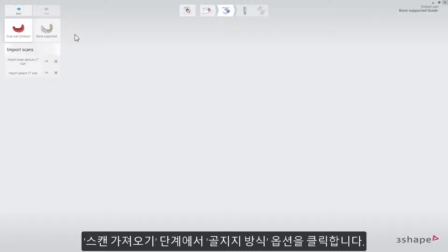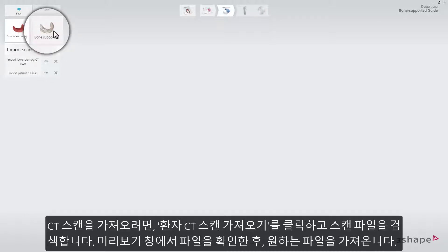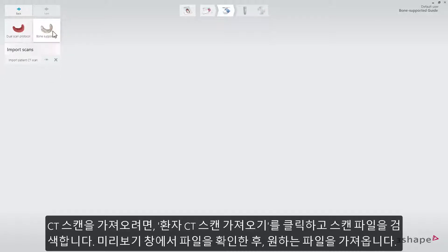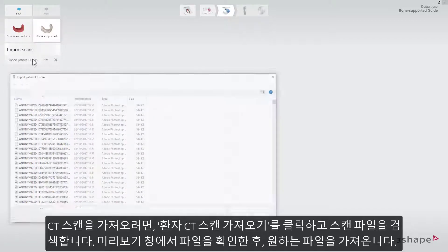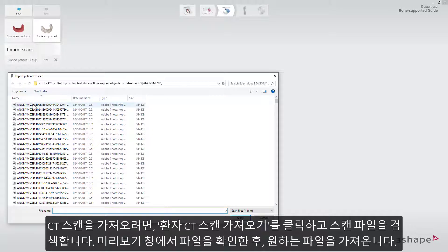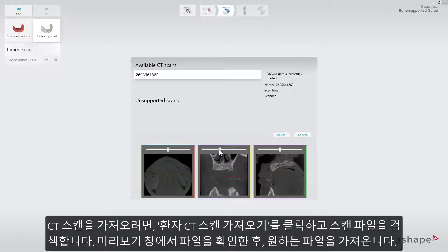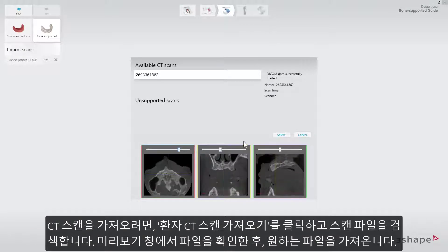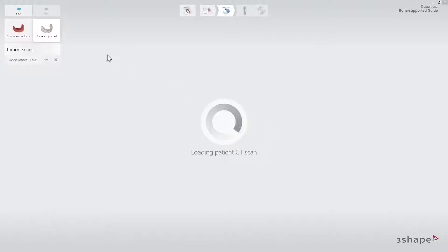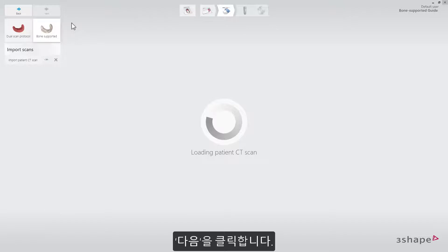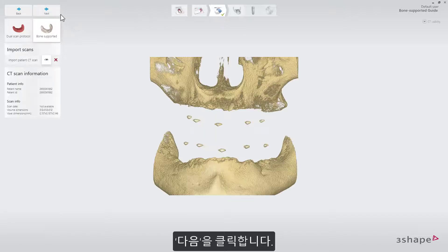While on the Import Scans step, choose the Bone Supported tab. To import the CT scan, click on the Import Patient CT Scan tab and search for the relevant file. Check it in the Preview window and select Correct. After doing that, click Next.